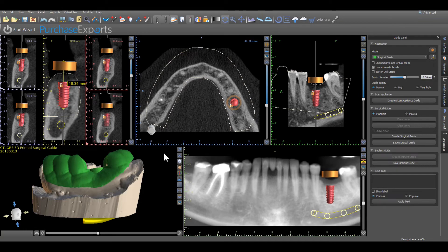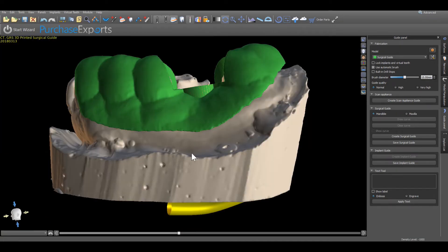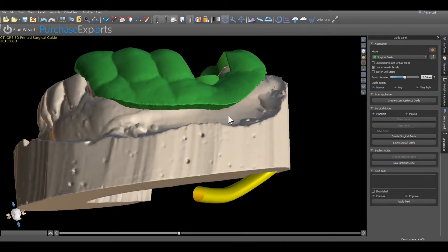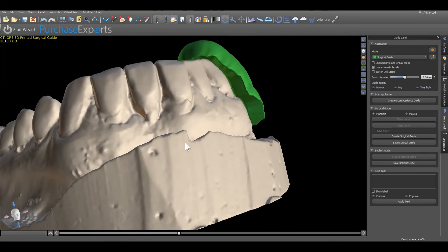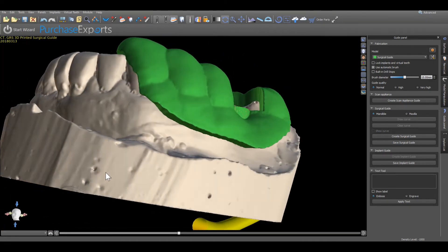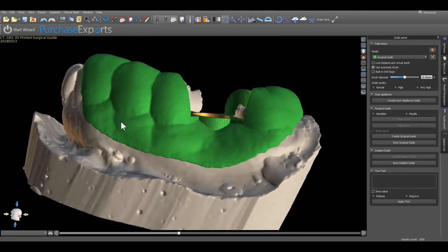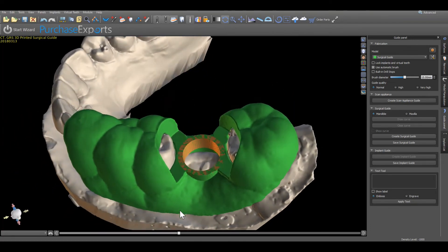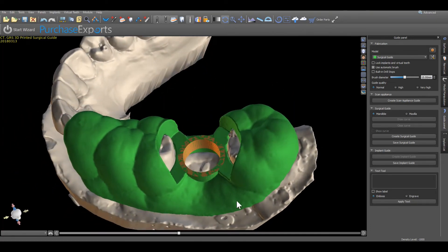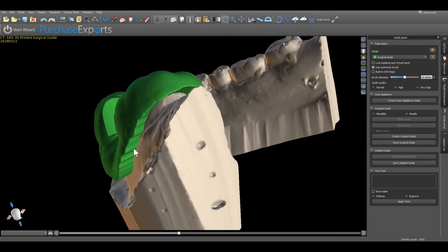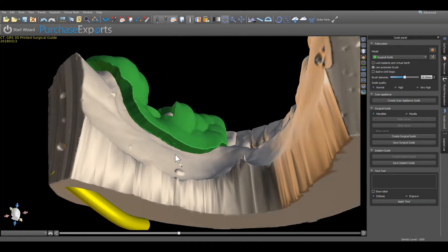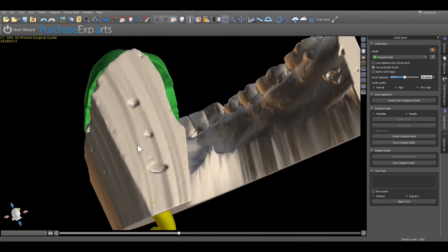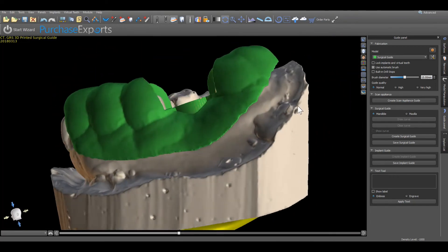Upon completing the surgical guide fabrication, in the 3D modeling window, view different perspectives of the surgical guide resting on the model by placing the pointer anywhere on the virtual image and holding down the left mouse button while moving the cursor in the desired direction. By rotating the surgical guide resting on the model, the design of the guide and overall adaptation of the guide to the model can be observed.